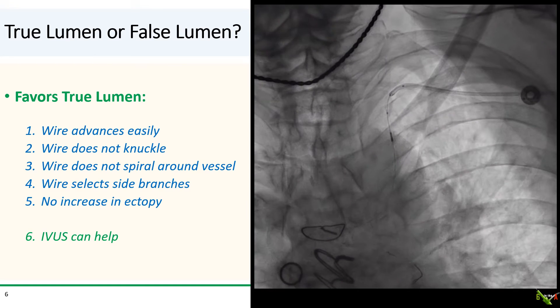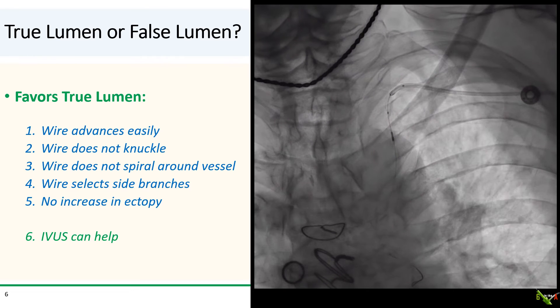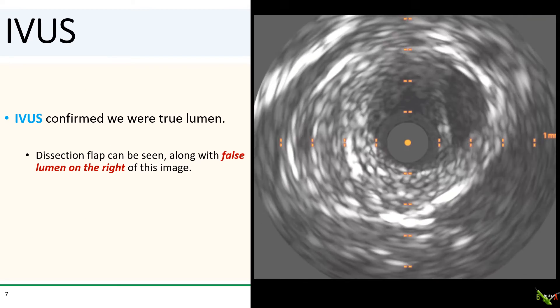If your patient is stable, there are a few other options. If there are pre-existing collaterals, or potentially flow from the natives, you can try to get contralateral access to do a contralateral injection to help you. Alternatively, you can use IVUS, but the IVUS catheter itself can enlarge the dissection plane. Many of us do a distal microcatheter contrast injection, but this is fairly risky — if you were in the false lumen, your microcatheter injection has just dramatically enlarged that false lumen. So we decided to reach for IVUS to help us.